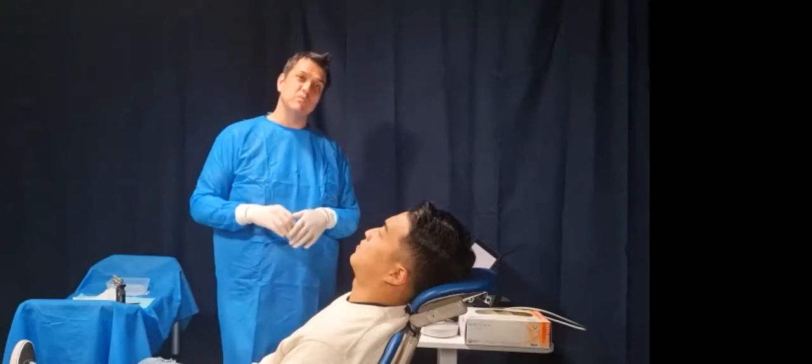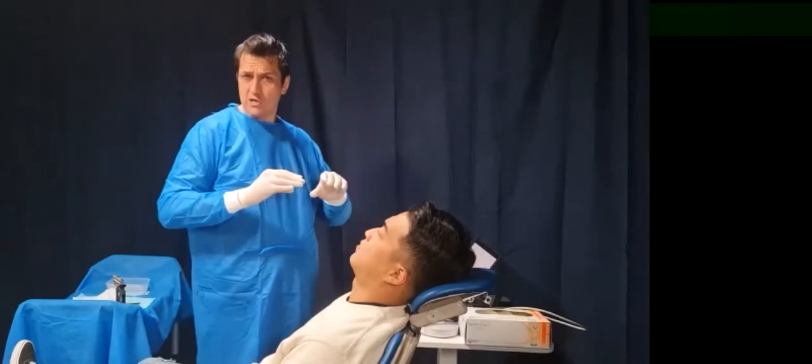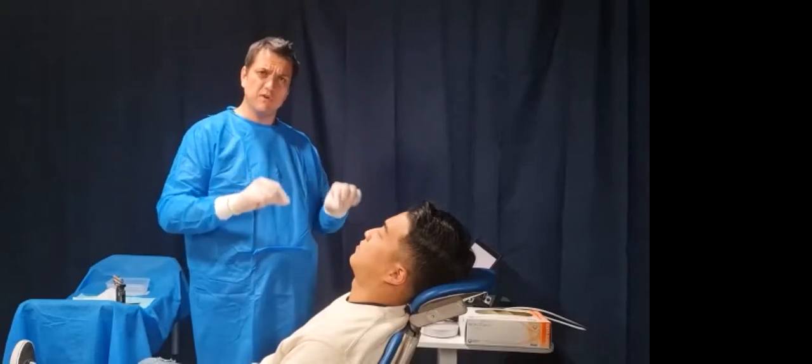And again, the second thing, I keep skipping it, don't I, is the other good indication from this technique. When you want to do a full mouth oral rehab, it's a great way to actually open the occlusion, and then your lab can actually restore to the open occlusion that you've provided them. It's very accurate because the patient verifies.